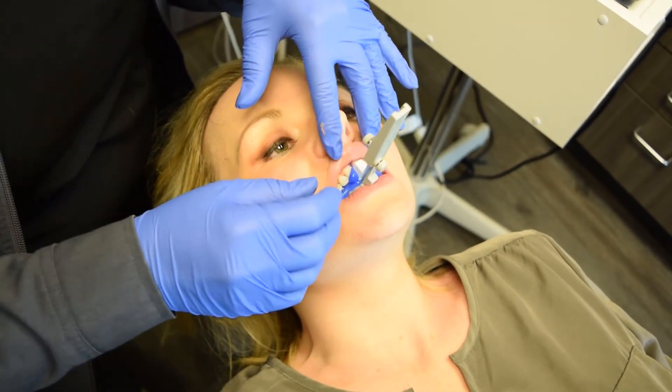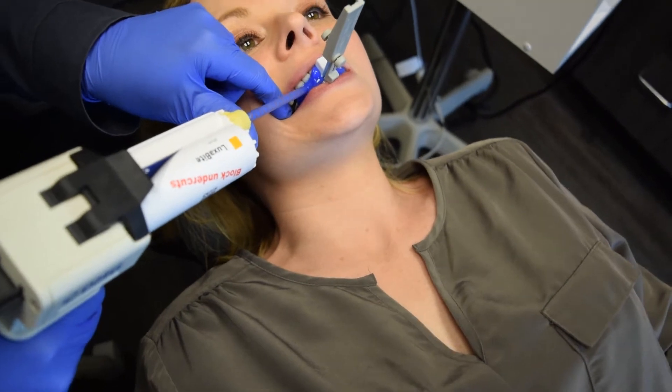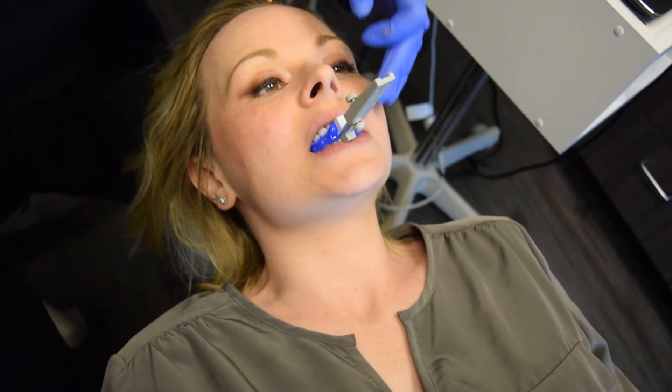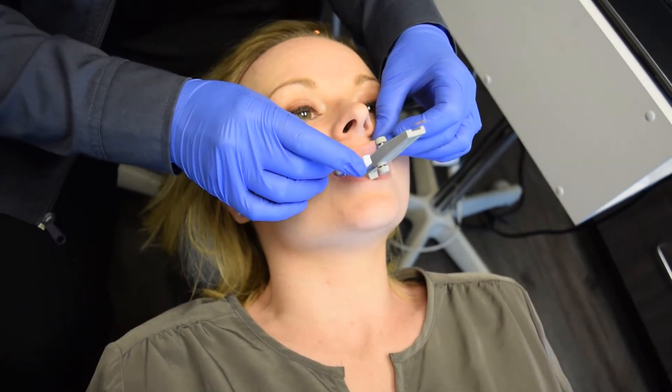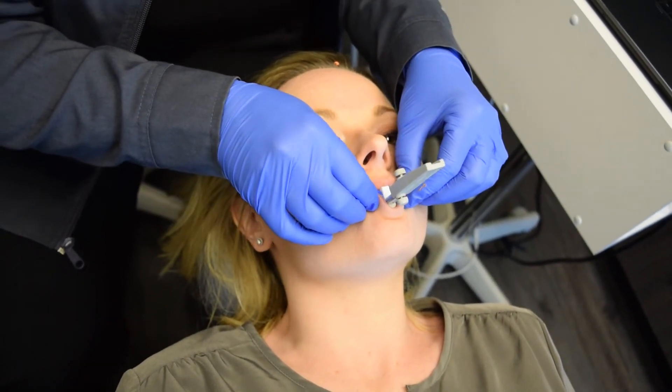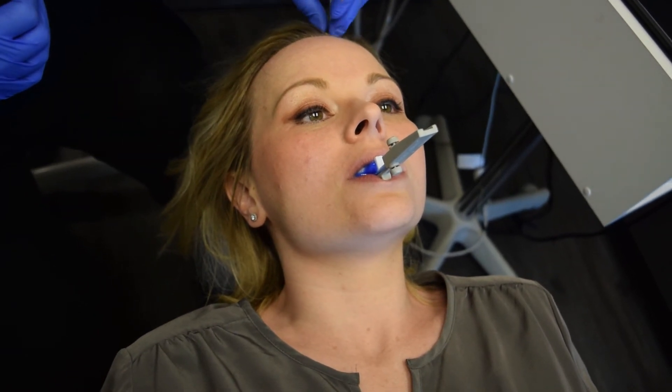Just enough to cover the incisal edges or the occlusal edges of the posterior teeth. You can easily add to this — there's a little bit more working time with luxabite if you're using it for crown and bridge or some other reason. Just be careful not to put too much in, because it's a great material and it's rigid, so you don't want anything locking into place too much. This is a very predictable way to take a bite for a dental sleep appliance with a scan bite using a George gauge, either capturing the front six teeth only or the front six and the molars as well.